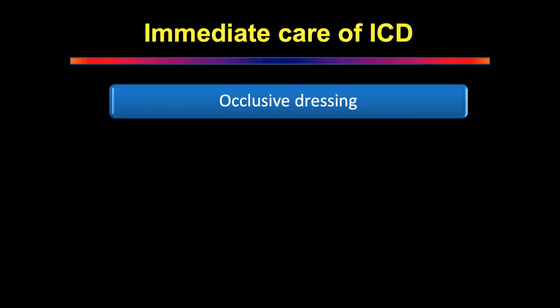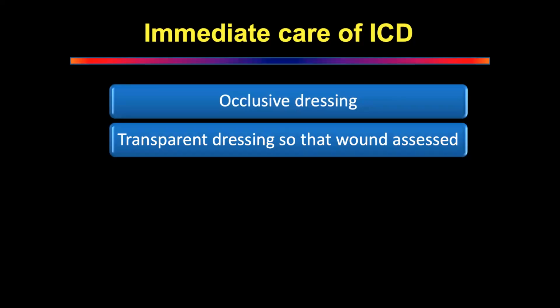It should be transparent if possible. If it's a long-term drain, if possible, you need a transparent dressing so that you can see the holes where they are. Good idea, so that the wound can be assessed. Okay?